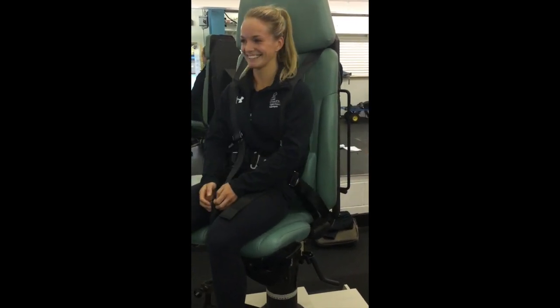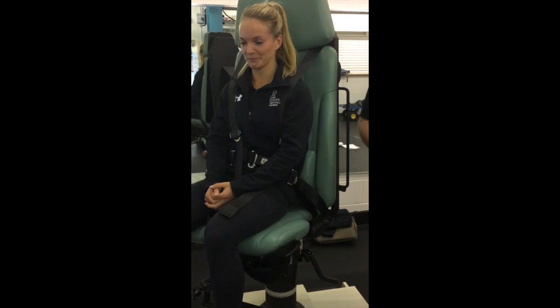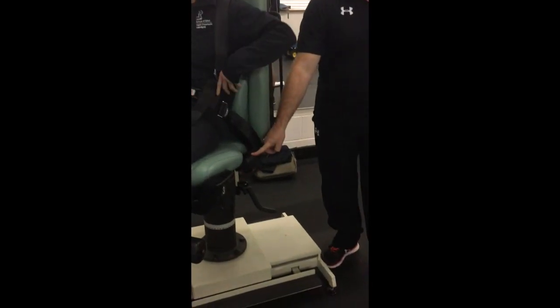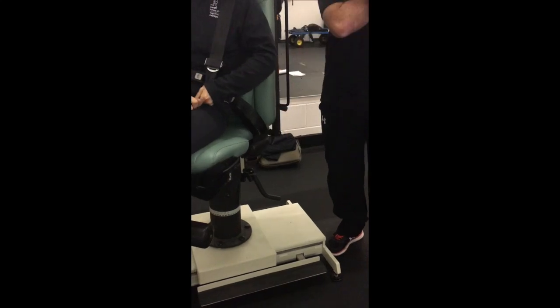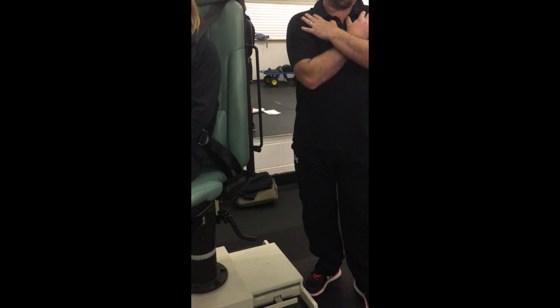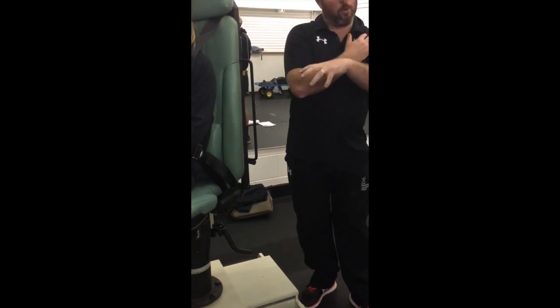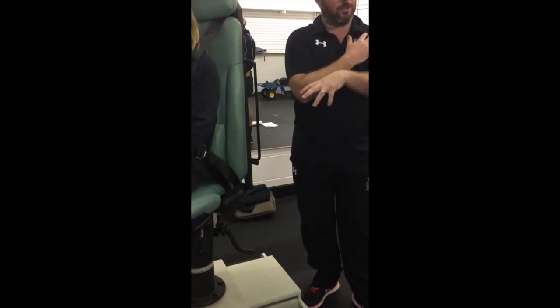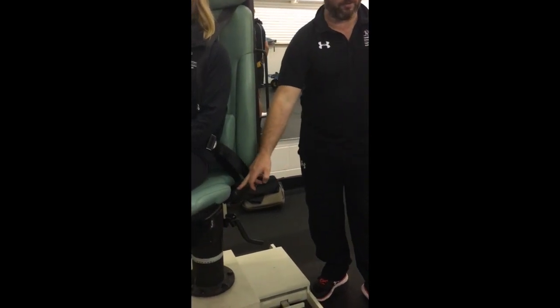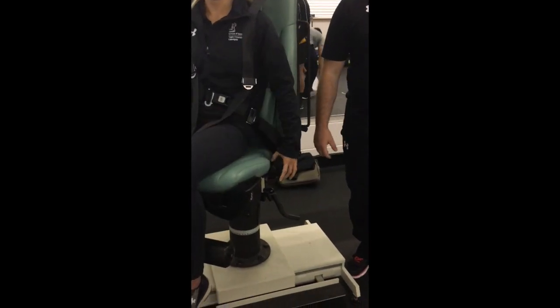Yeah. And basically you want to get them as stable as you can, so they're going to be quite uncomfortable in it. There's handles here that you can hold on to during the test, or you can have them fold their arms across their chest. Whatever you do, just do it consistently. Okay, hands across the chest means you'll probably get more work from the muscle, but they're working from a less stable base. So I tend to let them hold on. You really want that, if you're going for maximal contraction anyway.